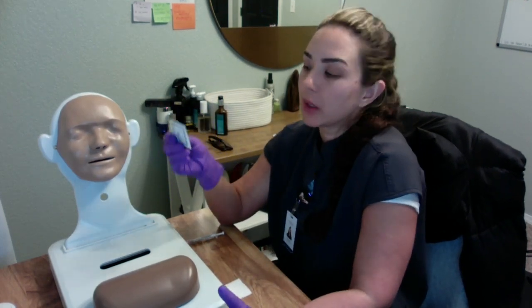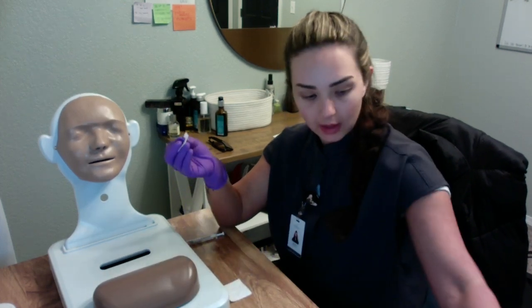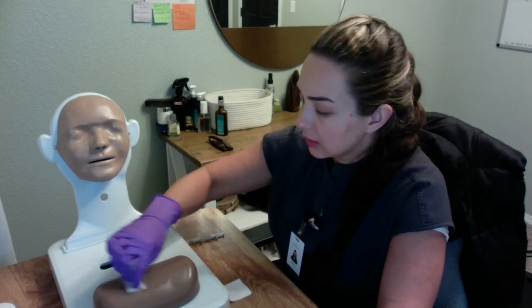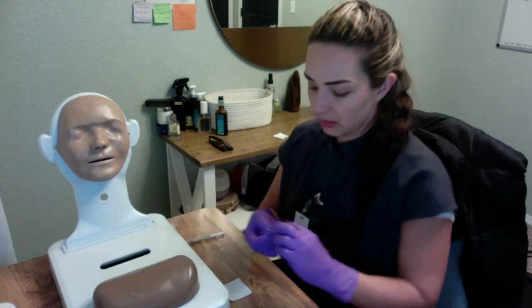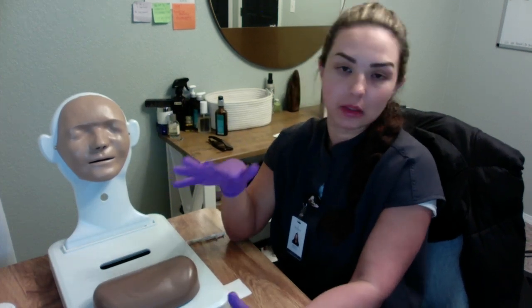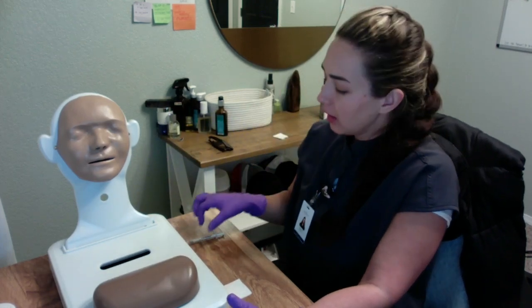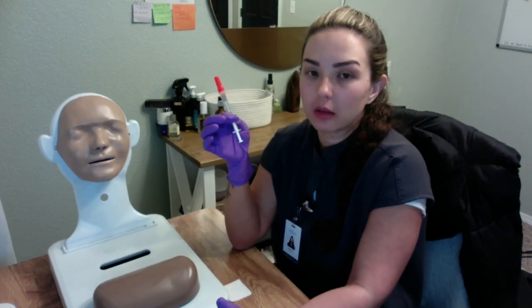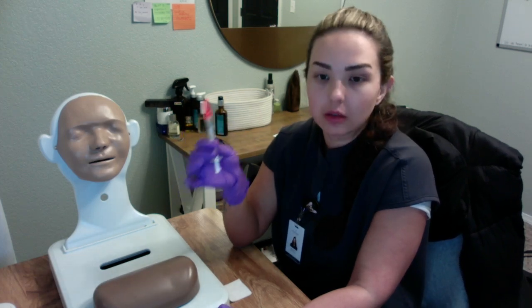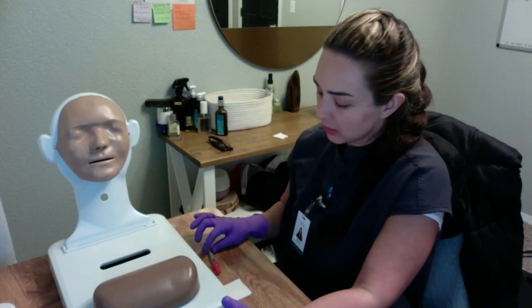Next, we're going to go ahead and sanitize the site. Okay, and we're going to do it starting in the middle, working our way out 2 inches. Okay, and we're going to dispose. And we never want to touch the site once it's been sanitized. We always want to allow it to dry. We never want to blow on it or anything like that. So again, before we administer the medication, we want to double check the dosage to the MAR, make sure that it is the correct dose.